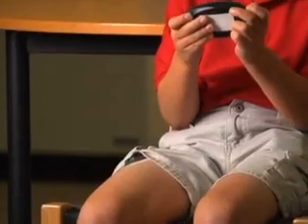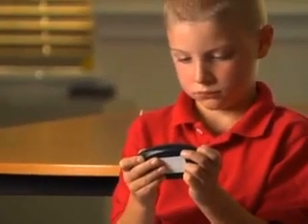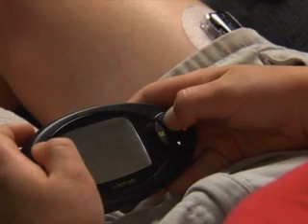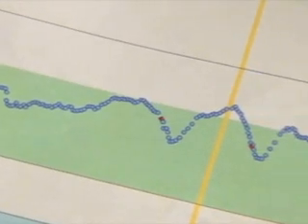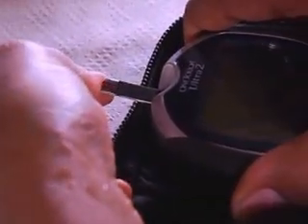Some students may wear a continuous glucose monitor, referred to as CGMS. It continuously monitors blood glucose levels through fluid in the tissues. CGMS can be useful in detecting the onset of hypoglycemia and hyperglycemia, and monitors blood glucose patterns and trends. However, CGMS is not a substitute for finger stick checks. Blood glucose levels should always be confirmed with a finger stick check before any treatment or action is taken.